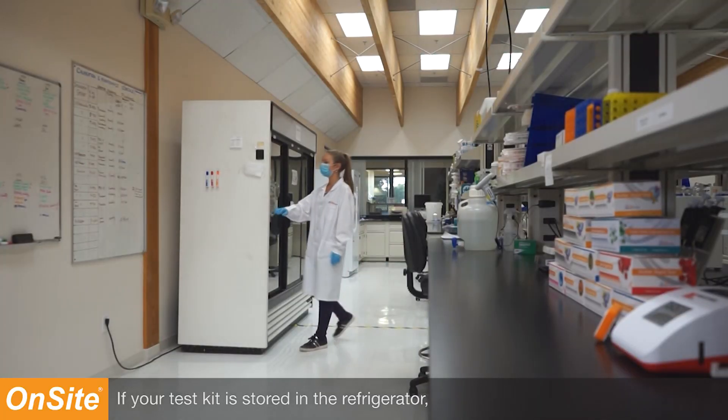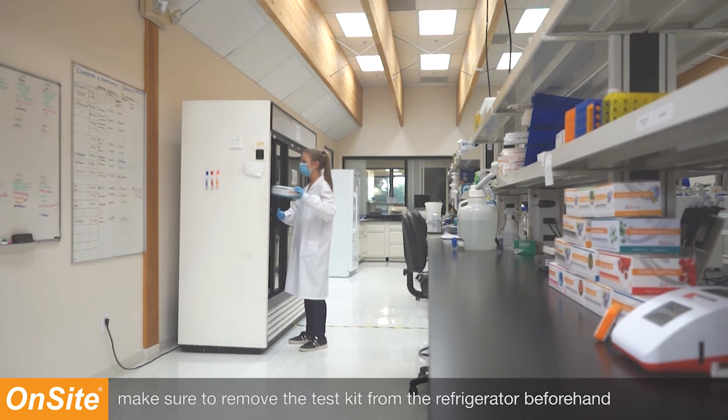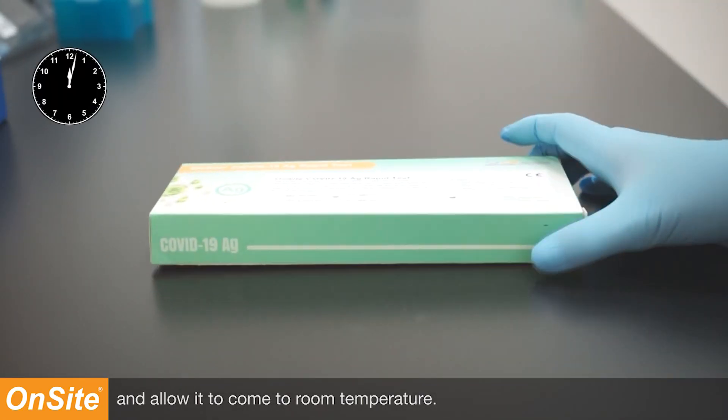If your test is stored in the refrigerator, make sure to remove the test kit from the refrigerator beforehand and allow it to come to room temperature.